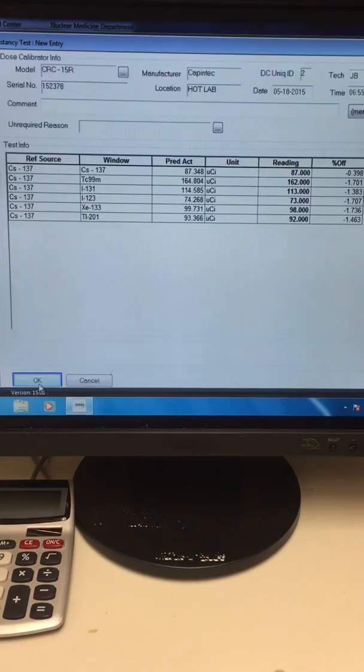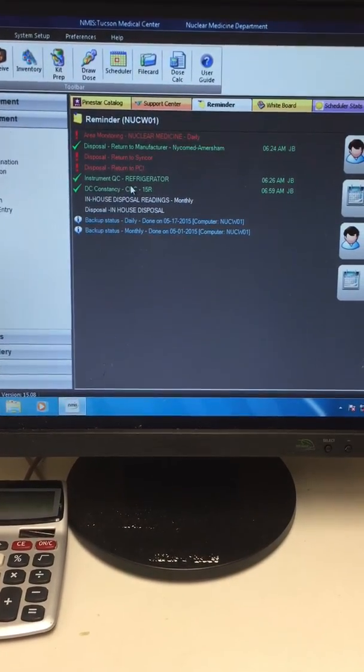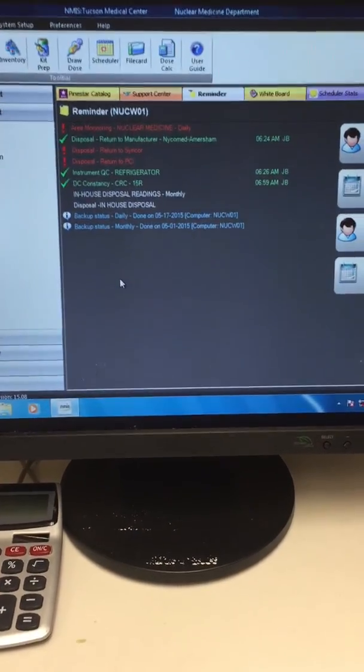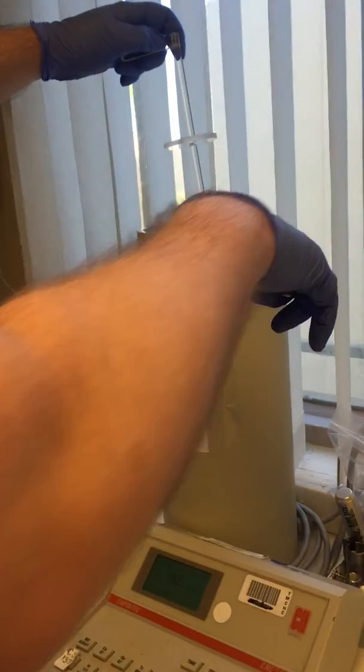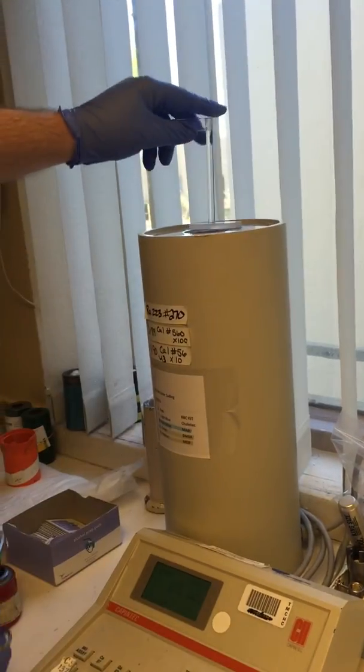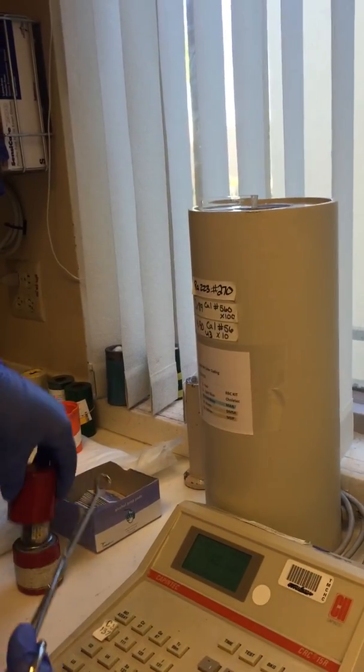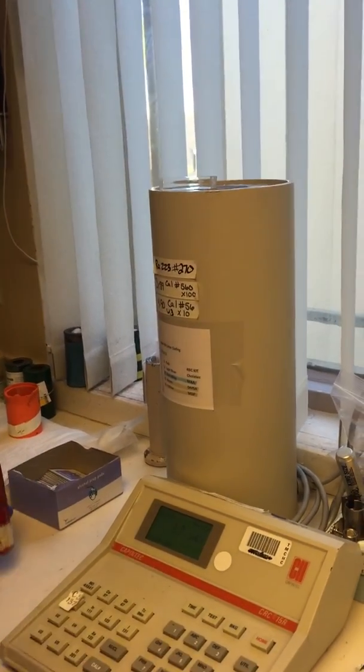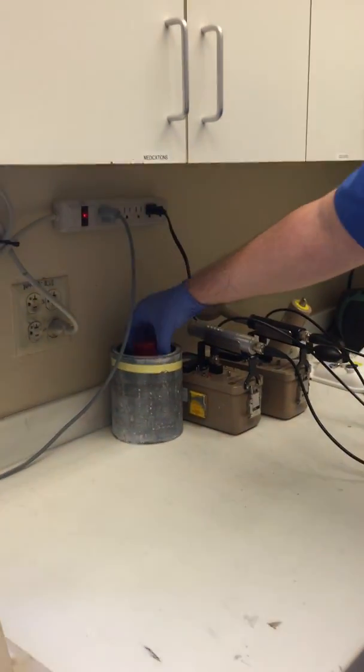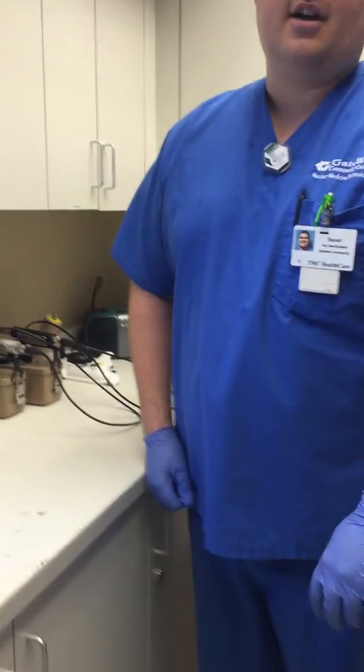So we're done with that. We're going to push okay. So that's green. So that's done. So now we're going to come over here. We're just going to put away our cesium source and put in this lead shield here. And then we're done with our constancy test.